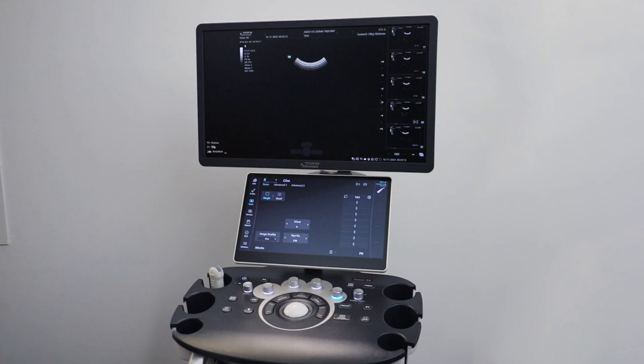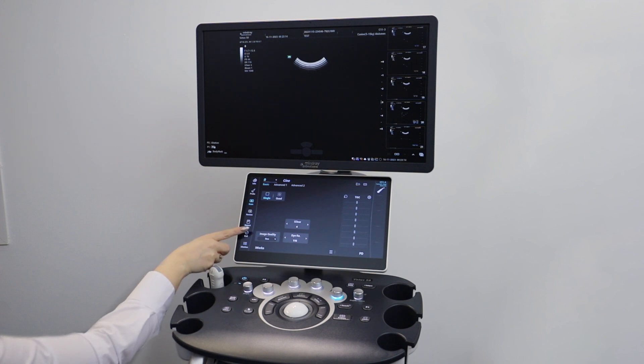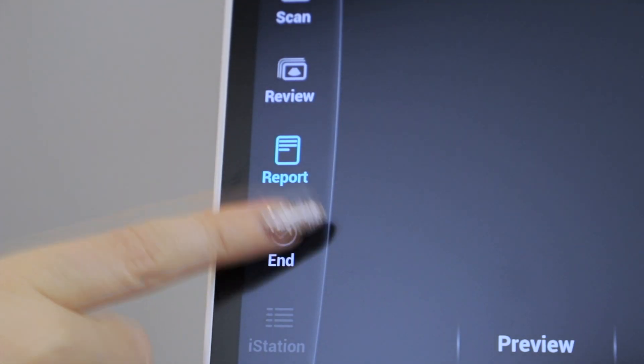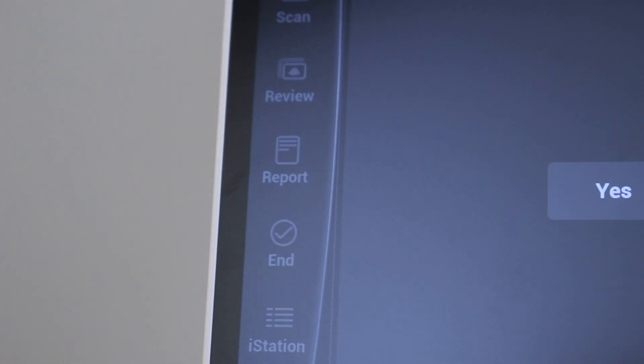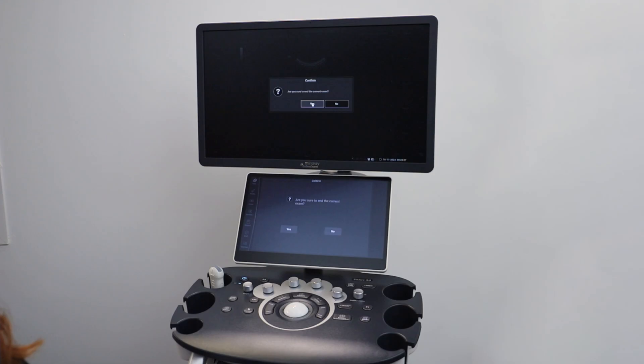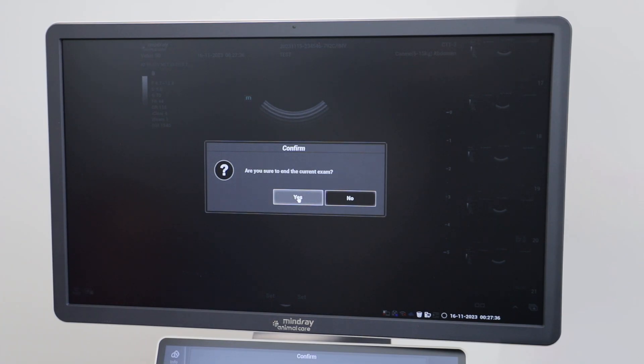Once you have finished your exam, press the end button on your small screen located on the left hand side. This will ensure all of your images will be saved to your patient file.